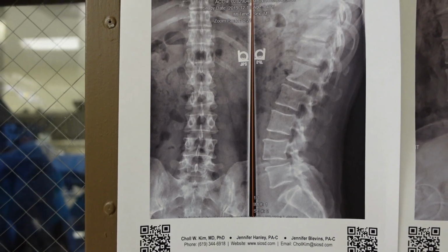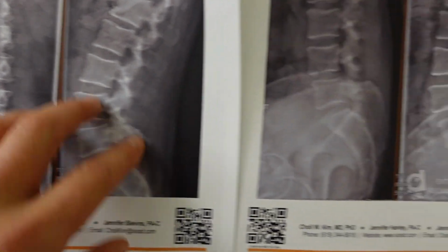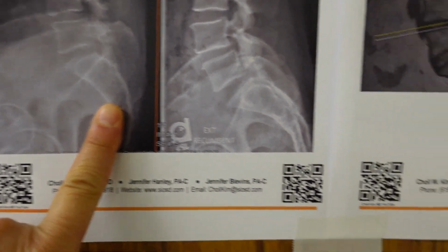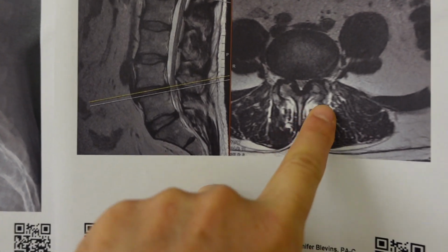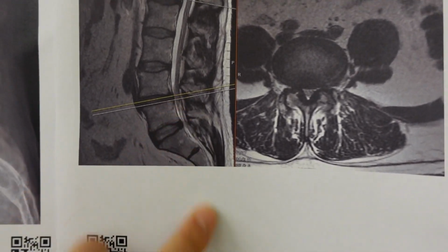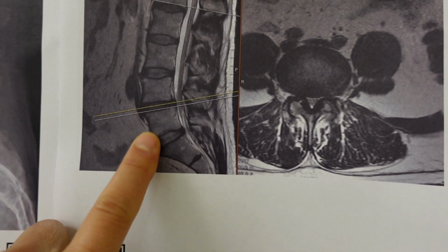We have one of my favorite cases today, a degenerative spondylolisthesis with back pain and stenosis at a single level. You can tell on flexion extension views there's motion, and then on MRI there's lots of facet arthropathy, stenosis, bulging discs, ligamentous hypertrophy, and stenosis. So we'll do a minimally invasive lateral interbody reconstruction because he's young and very active.